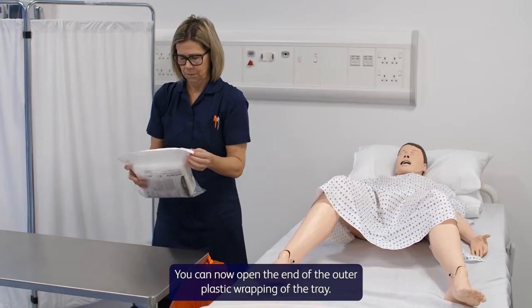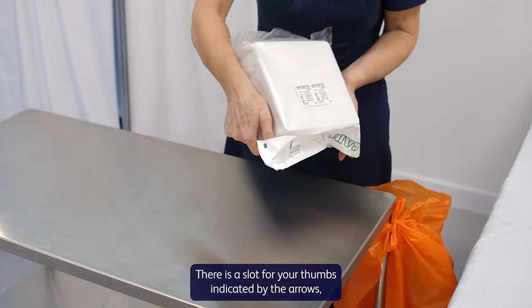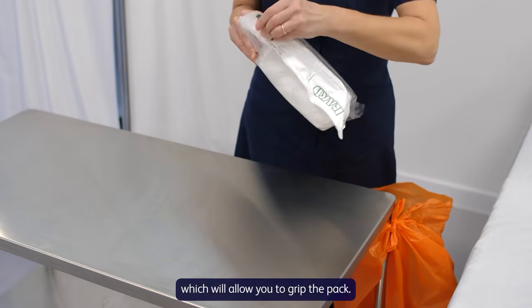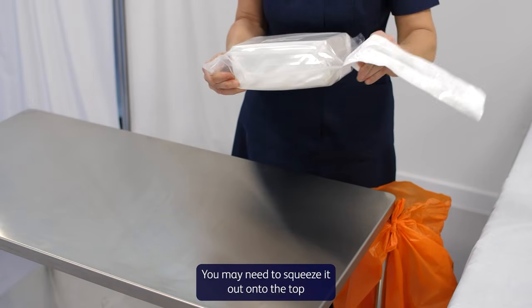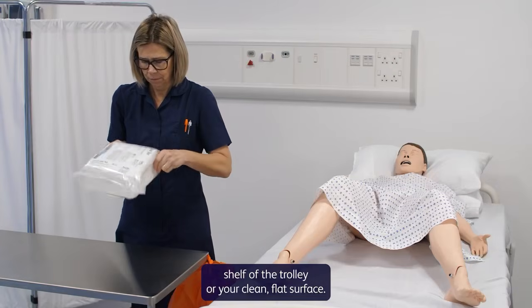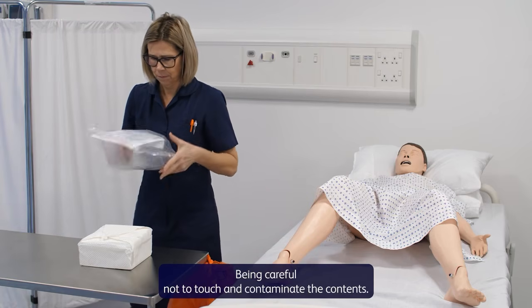You can now open the end of the outer plastic wrapping of the tray. There is a slot for your thumbs, indicated by the arrows, which will allow you to grip the pack. Empty the tray from the outer plastic wrapping. You may need to squeeze it out onto the top shelf of the trolley or your clean flat surface, being careful not to touch and contaminate the contents.